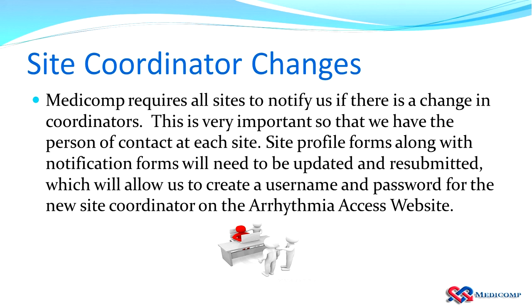As soon as you know that there will be a site coordinator change at your facility, please let us know. This is especially important in light of what we just discussed regarding the notification criteria. As stated in the previous slides, Medicomp has not provided any of the study participants' contact information, so if a patient is found to have serious arrhythmias and/or symptoms, we need to be able to contact the study coordinator to make sure that the correct patient follow-up is implemented.